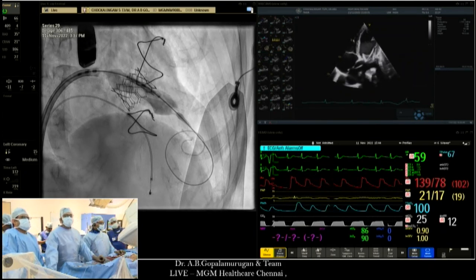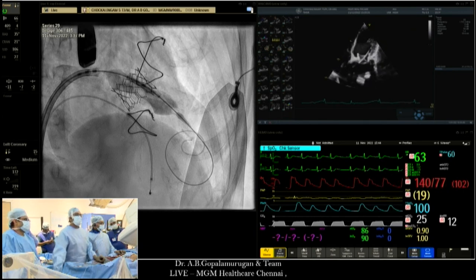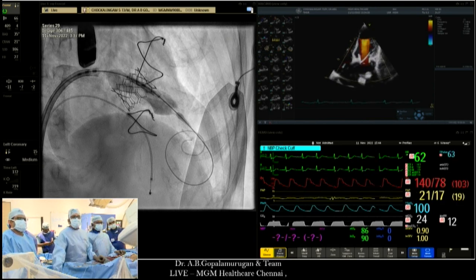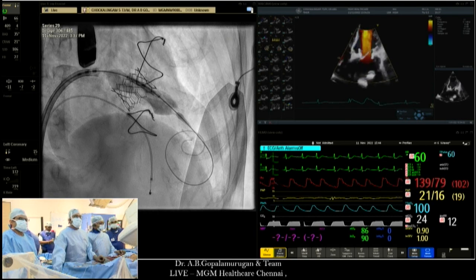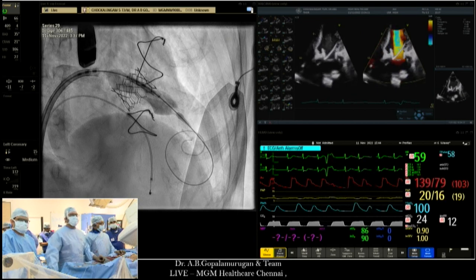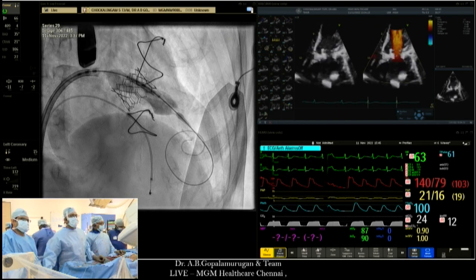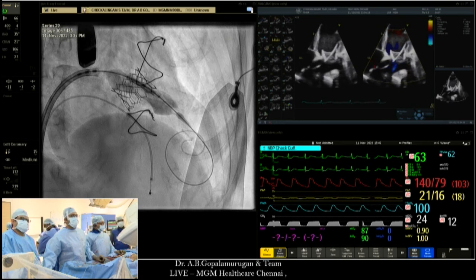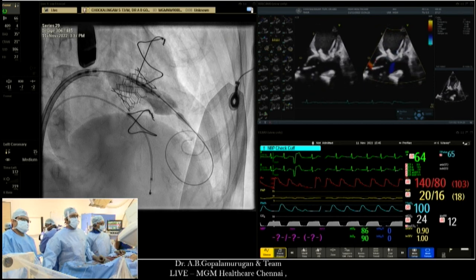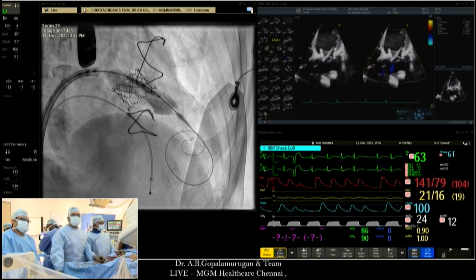That's a beautiful demonstration, Gopi. Excellent result, Gopal. What do you do about the ASD? Gopi, can you hear? Yes, I can hear you very well. Great discussion about the transseptal closure. When we started TMVR, back in 2011, these were the world's first TMVRs, we always closed the transseptal access. But over time, now we don't close any transseptal. It almost always closes by itself, and there's no reason to put a device. And we don't even check the LA and RA pressures to decide if you need to do a transseptal closure. So we don't close at all.